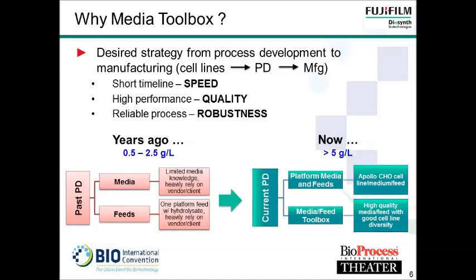Okay. So let's get to the topic. Why we want to do Media Toolbox? During the journey of process development, from gene all the way to manufacturing, including cell line development, process development, and manufacturing, regardless of the development stage as well as the clinical stage, it's always a desire to have the shorter timeline, high performance as well as reliable process, which are reflected by the speed, quality, and robustness.